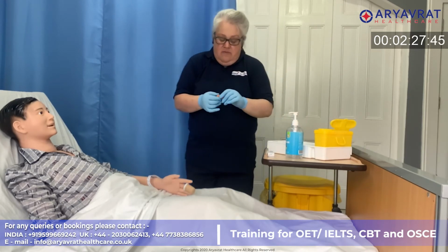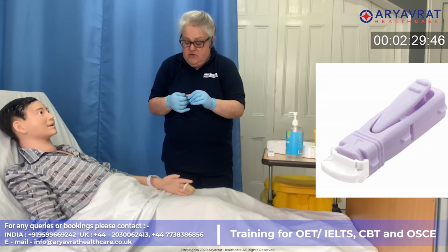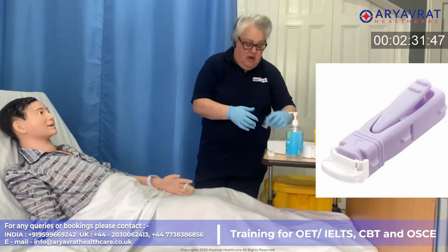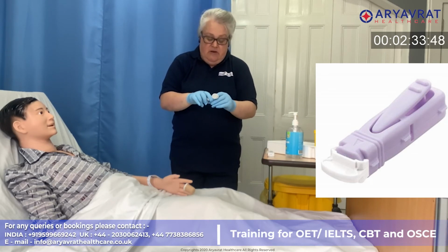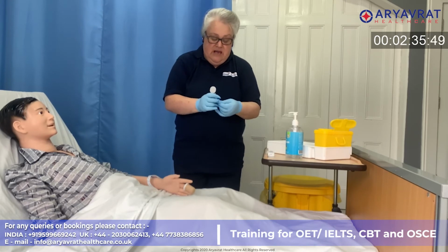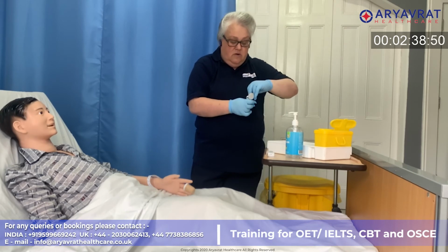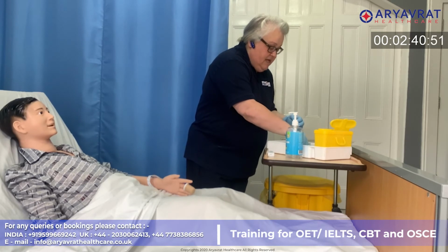So you may well use a pen with lancets at home, but in the hospital here we are going to use a single-use one, okay? I'm just going to get my test strip out ready. These are very fiddly, especially when you've got gloves on. Just one of those. I've already checked the expiry date and everything is okay.